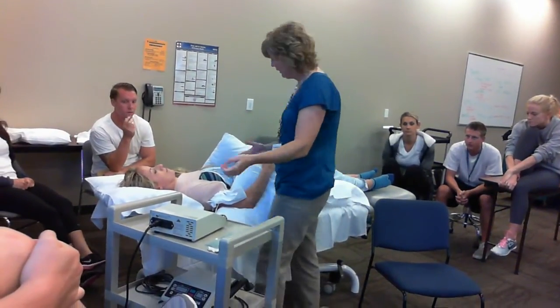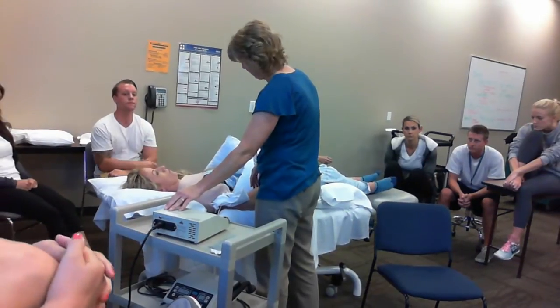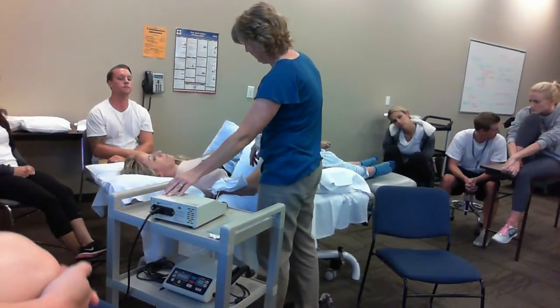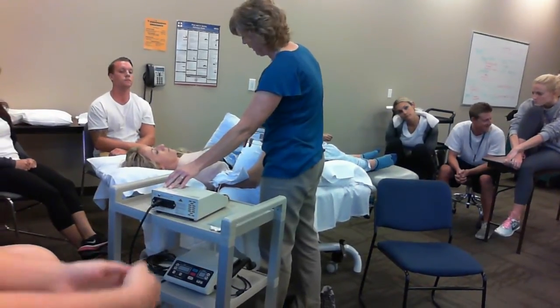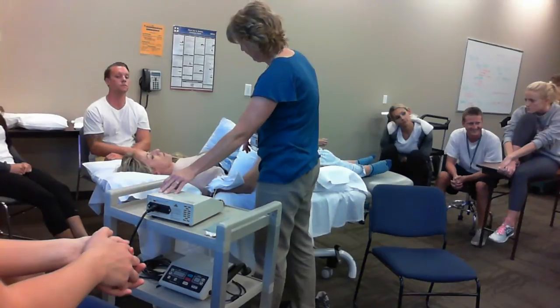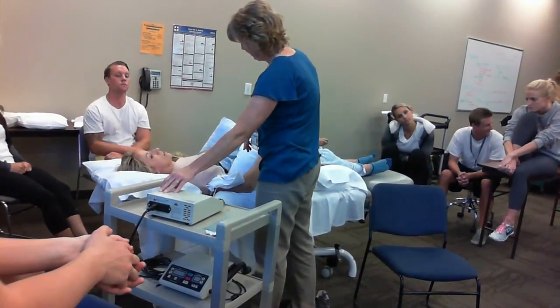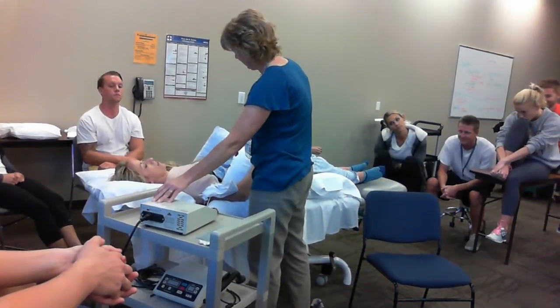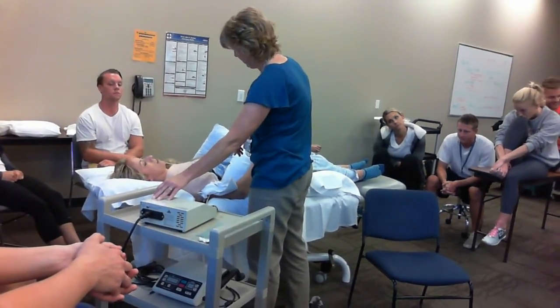And are you feeling anything yet? Okay, I'm going to continue to hold it. Okay, yeah, a little light tingling. May I go ahead and turn it up a little higher? I'm looking for that strong, comfortable tingling. Is it still comfortable? Still tingling, not feeling like it's pulsing in any way?